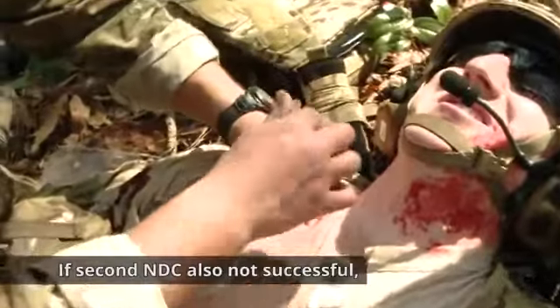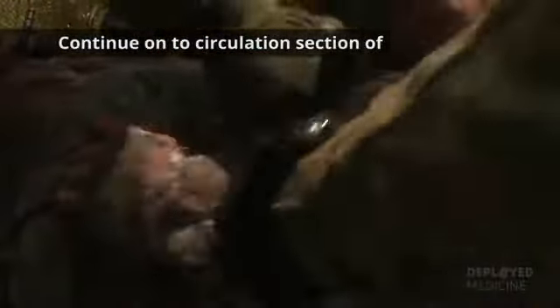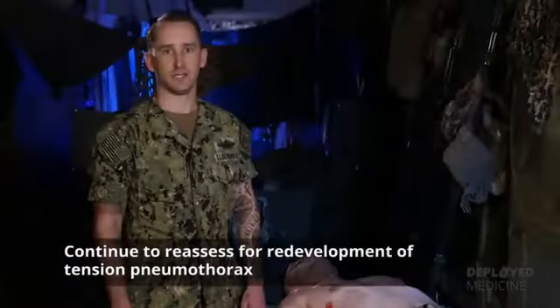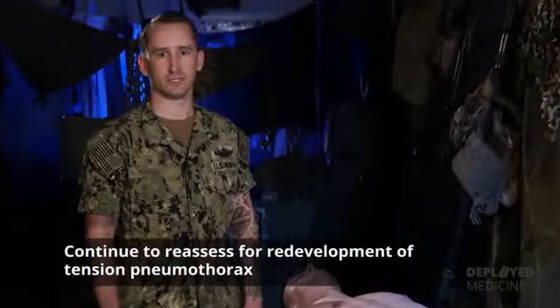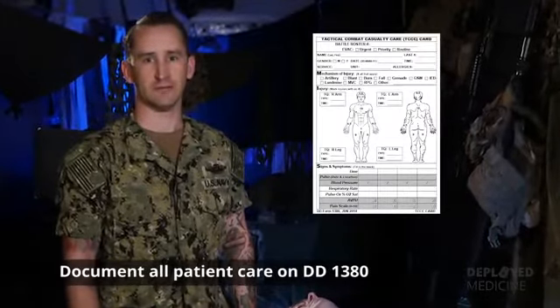If the 2nd NDC is also not successful, continue on to the circulation section of the Tactical Combat Casualty Care TCCC guidelines. Continue to reassess for redevelopment of a tension pneumothorax, monitor SpO2, and document all care on the DD Form 1380.